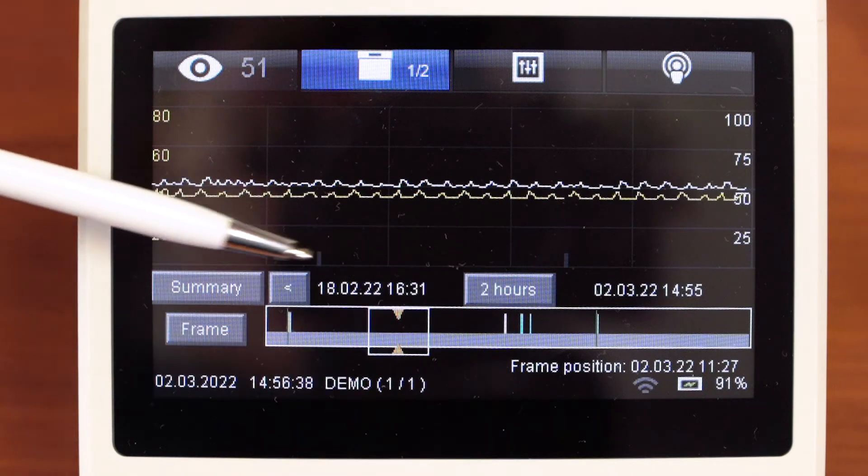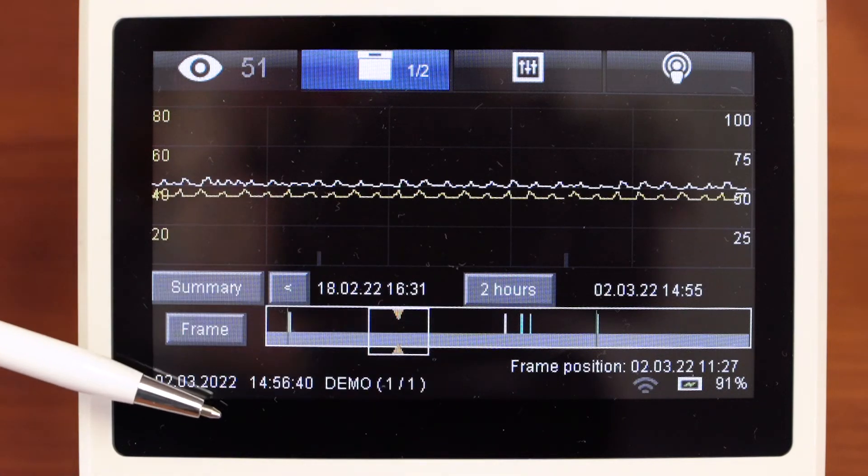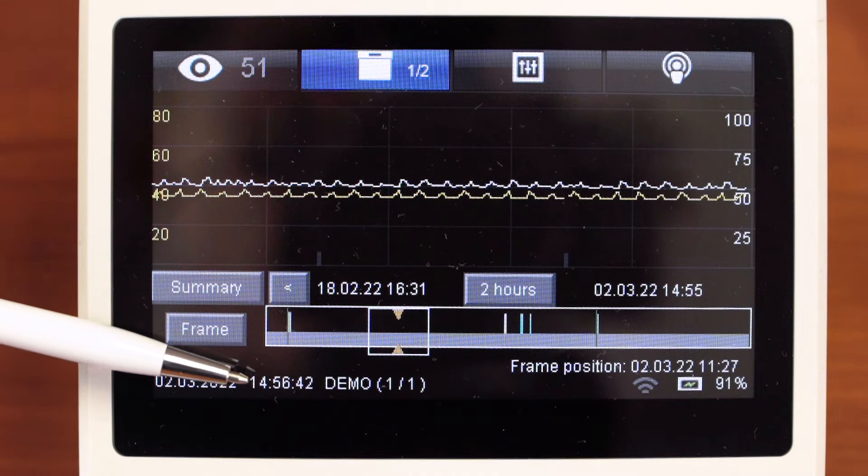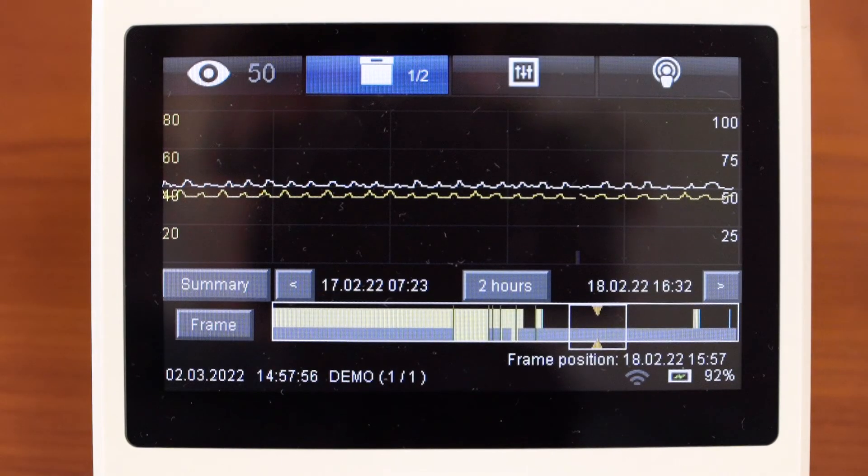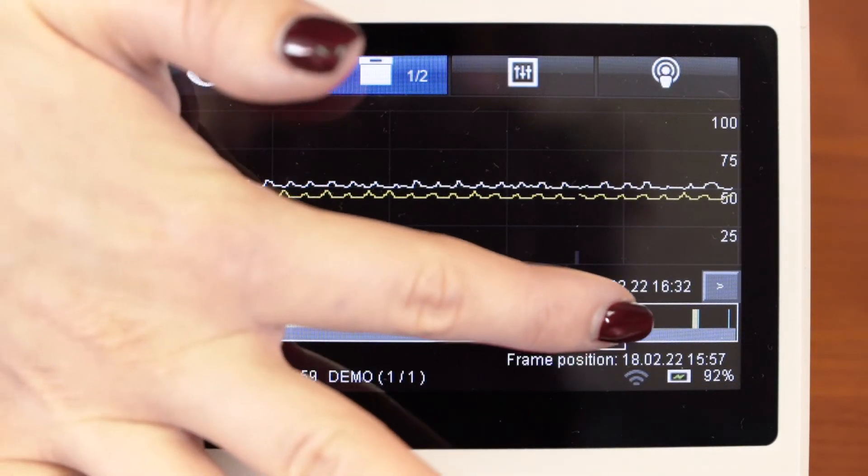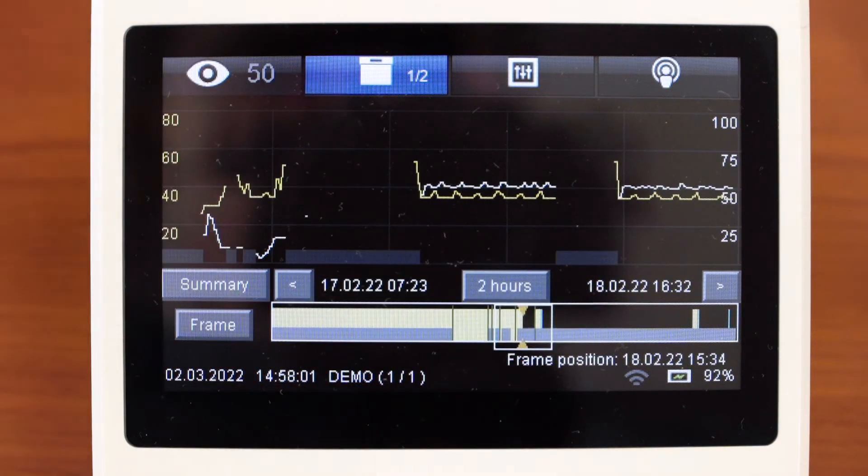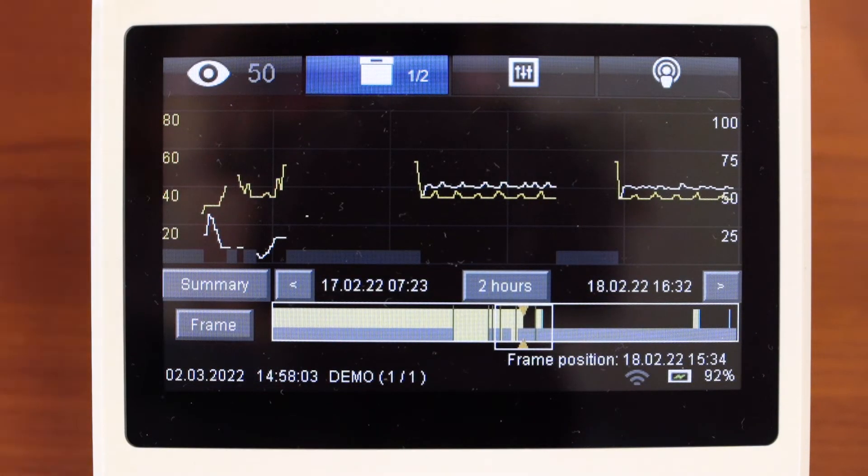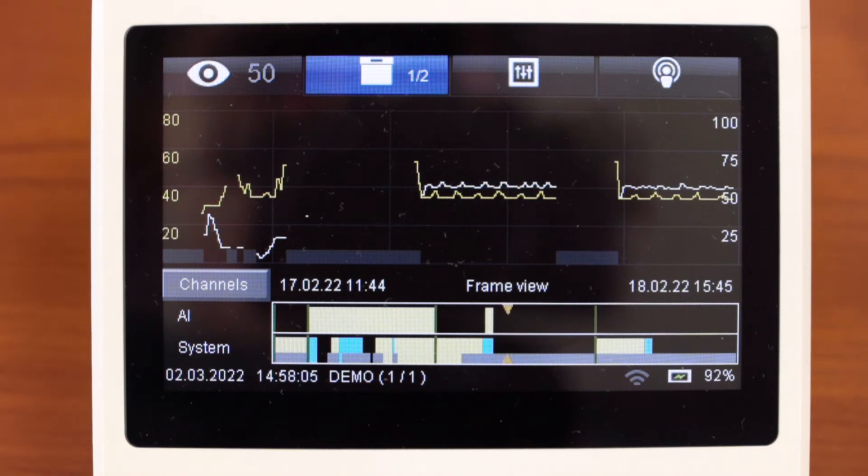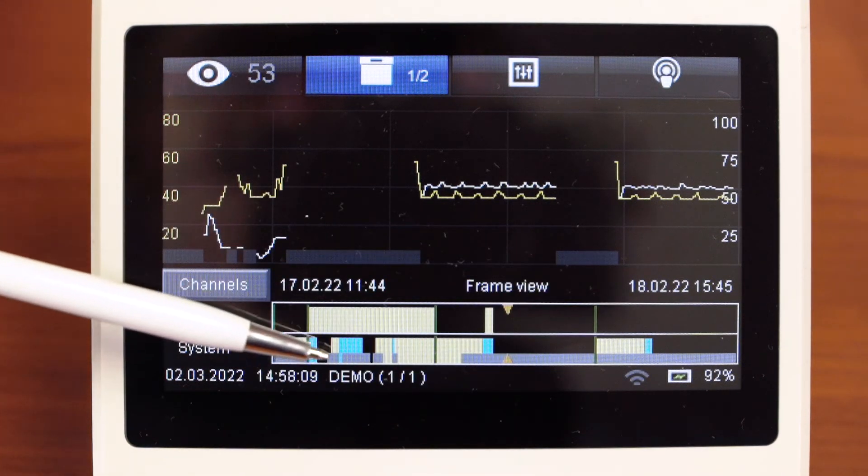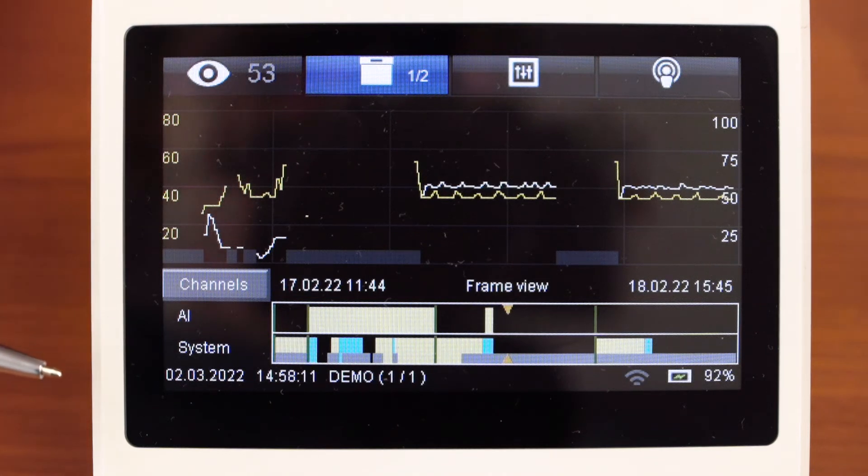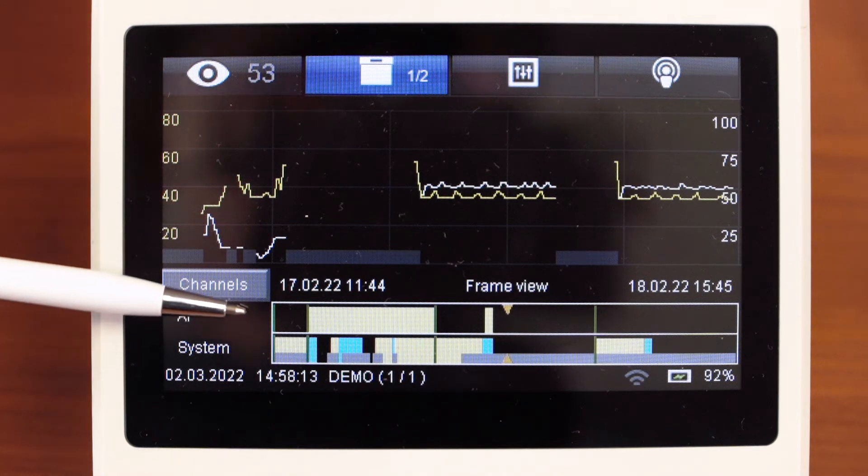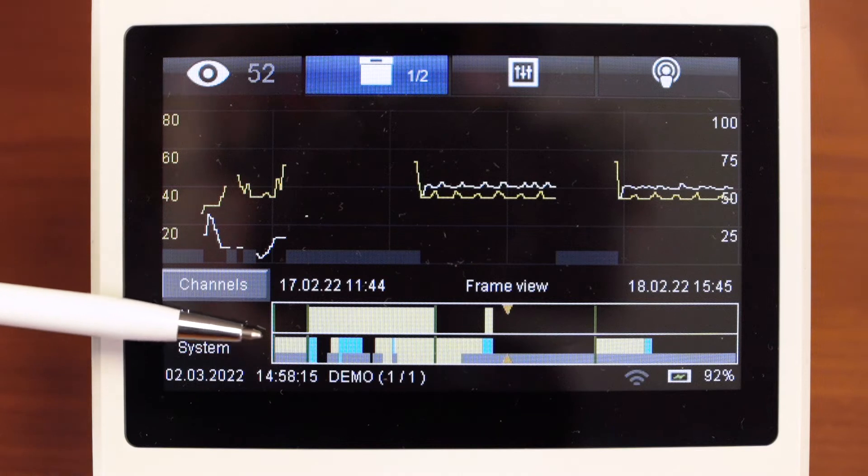Here is a field for alarm events and technical events. Using frame we can choose the most interesting part. Press summary. So we can see the part in details. There are two fields for activity index alarms and system alarms.